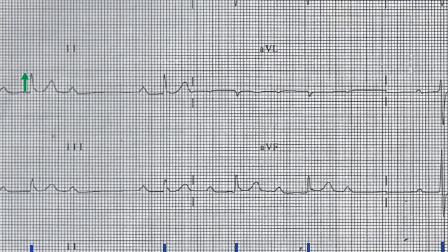P waves are present and in the inferior leads they have a slightly peaked morphology consistent with P pulmonale.